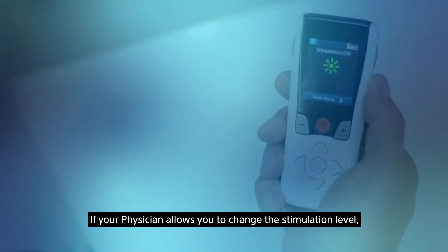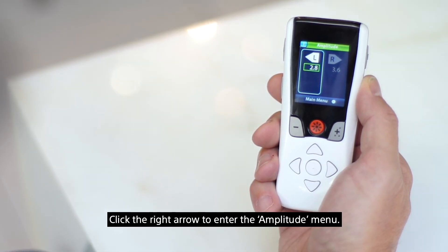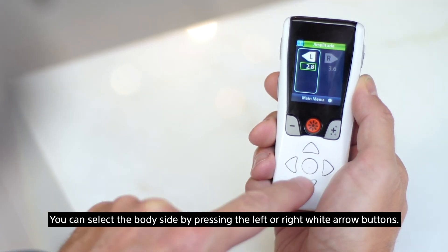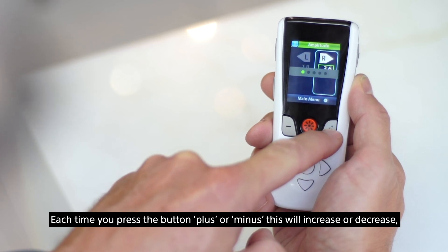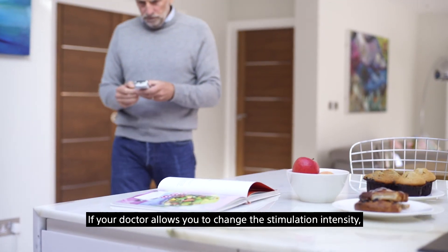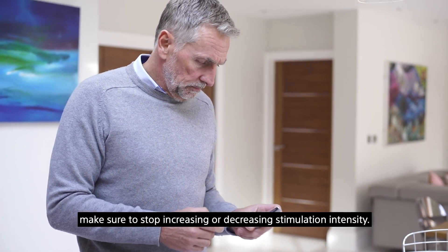If your physician allows you to change the stimulation level, you can adjust it from the main menu. Press the down button to navigate to stimulation areas, then press the right arrow to select it. Click the right arrow to enter the amplitude menu. On the amplitude screen, L corresponds to the left side of your body and R corresponds to the right side. Select the body side by pressing the left or right white arrow buttons, then use the minus and plus buttons to adjust the stimulation level. Each press of plus or minus will increase or decrease your stimulation by 0.1 mA. If you reach the limit of the allowable range, the 'limit reached' screen will appear. If you feel any side effects, make sure to stop increasing or decreasing stimulation intensity.